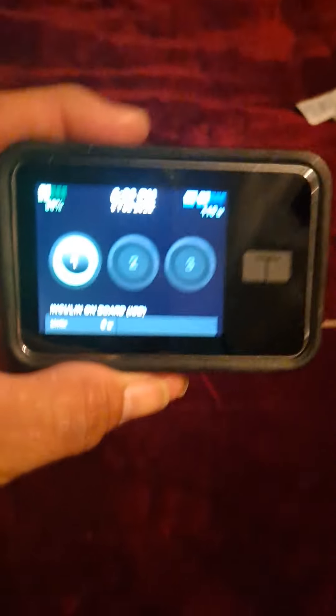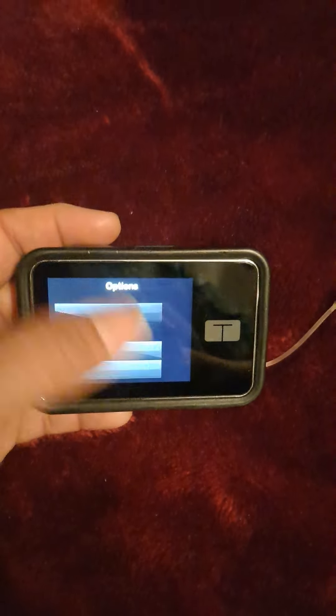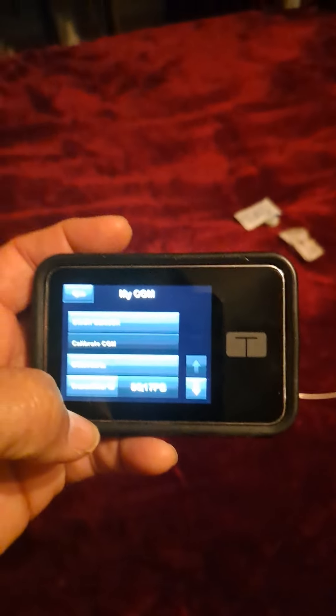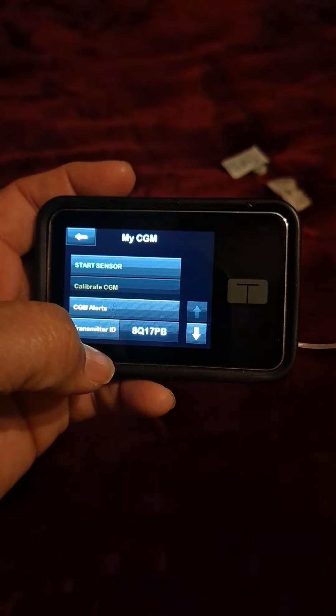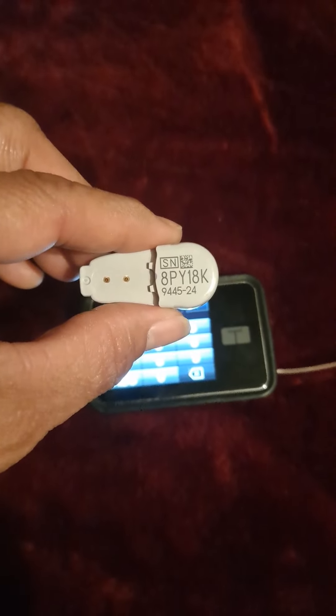Whenever someone hasn't been wearing a Dexcom sensor for more than 24 hours, the insulin pump screen shows three circles labeled one, two, three because it has no blood glucose to show. Go into Options, push the arrow down, go to My CGM, and at the very bottom it says Transmitter ID. That number shows the old transmitter ID, so click it to enter the new one — this one is 8PY18K.